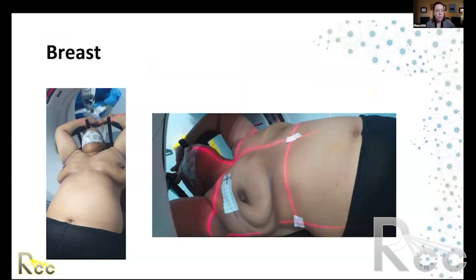And here is just another example. I think here I was looking at the chin position. Here's a patient that's being simulated flat. When the patient first laid down for the simulation, you can see her chin is not extended, and that could become an issue, most likely in the exit dose of the lateral tangent beam.